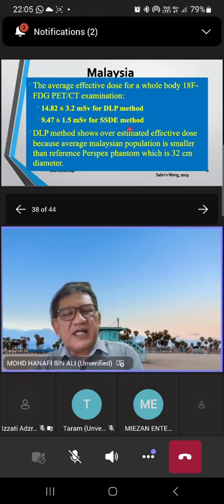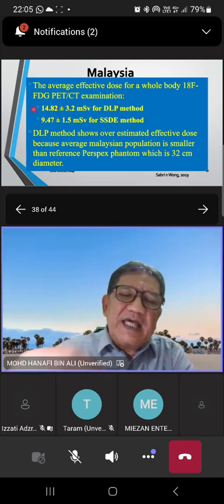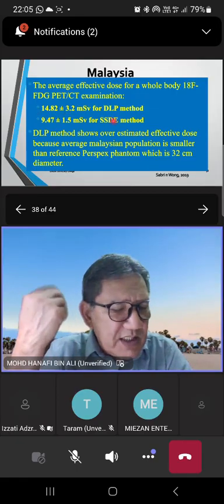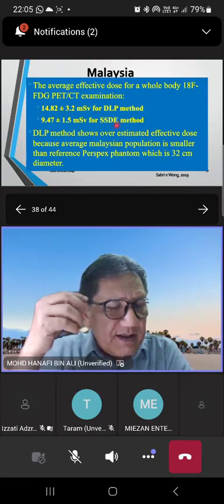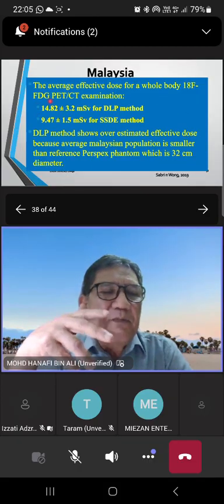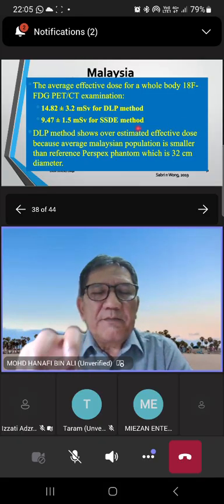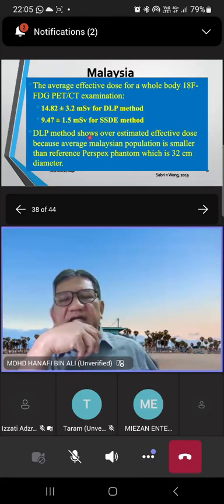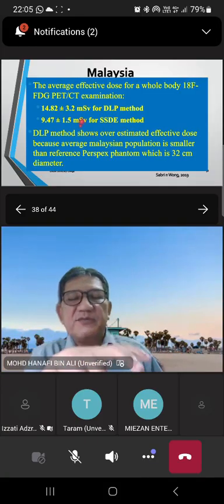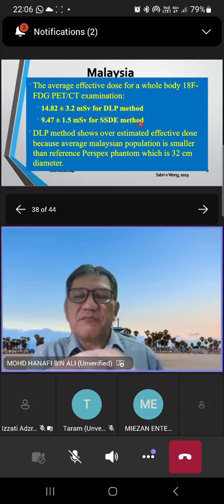And for your information, I really work quite close with my counterpart. He's a medical physicist at Semarang University there. The Diponegoro University, I think. That's why we publish a lot of articles using CT scan. Yeah, and he also developed two software to measure CT scan dose. This software is free.